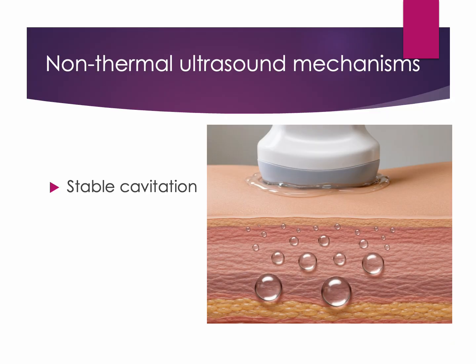One non-thermal effect of ultrasound is stable cavitation. Stable cavitation is a phenomenon in which small bubbles in a liquid oscillate in size due to acoustic pressure from the sound waves. These bubbles create fluid flow and accumulating dissolved gas, which can promote beneficial bioeffects.